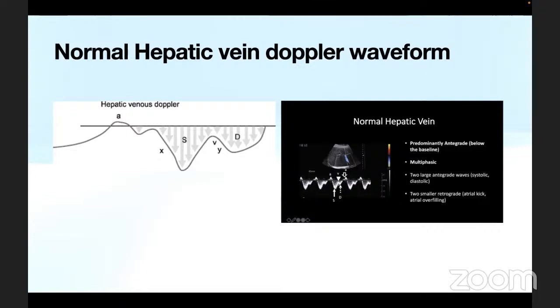There is no requirement of understanding all the dynamics of ultrasonography and all the waveforms. The only advantage of VExUS is that it is a pictorial description where you can see and immediately understand what is happening to the patient.